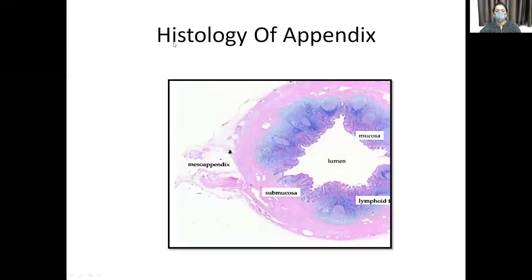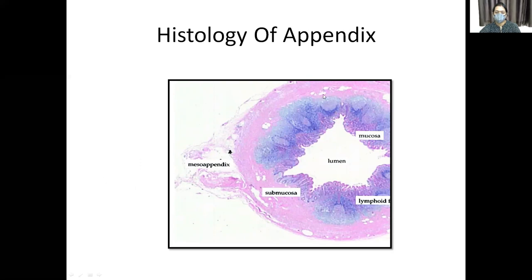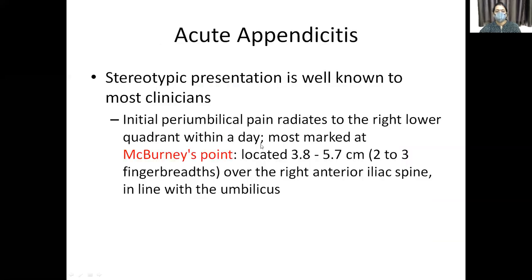The appendix is a finger-shaped structure, so on transverse section we see a lumen. The mucosa is lined by columnar epithelium with lymphoid aggregates in the lamina propria, then the submucosa, followed by the muscular layer (circular and longitudinal), and then the serosa.